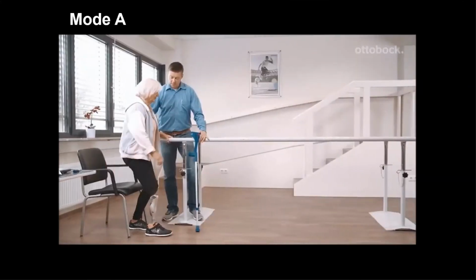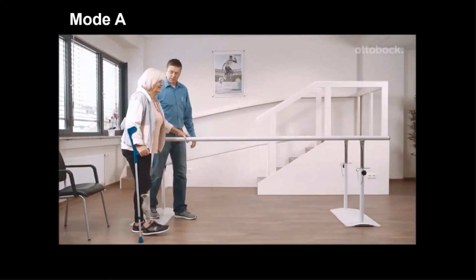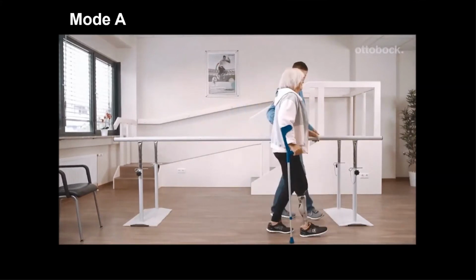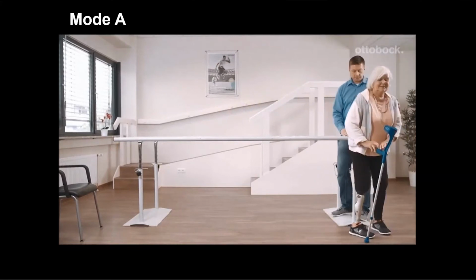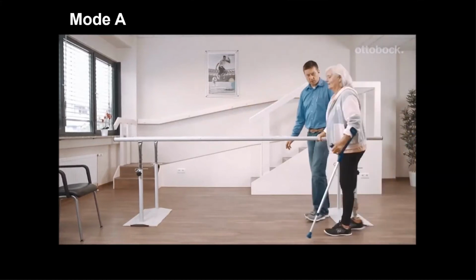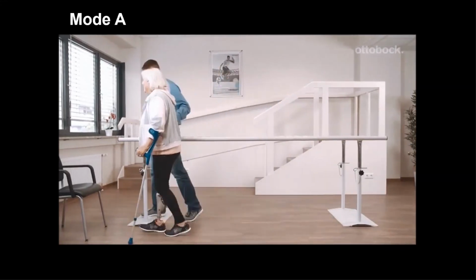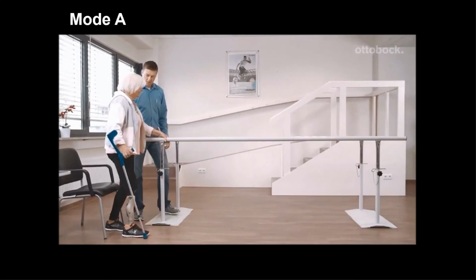And next slide, Dr. Kannenberg. And here we have mode A. So this is a truly locked knee. So the individual goes from a locked position, from a sitting position to a fully locked knee. So very good for gait training, shifting weight, learning with an assisted device, getting confidence and shifting their weight onto that prosthesis. And then they can come back to the chair and they don't have to pull on a cable or worry about that knee not releasing on them when they go to a seated position. The knee knows that they're going to sit down and releases for them.